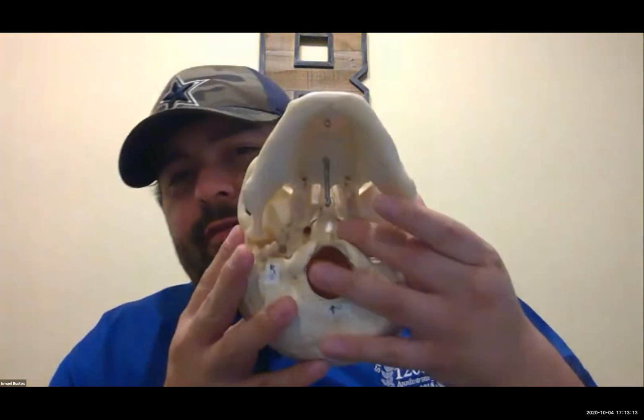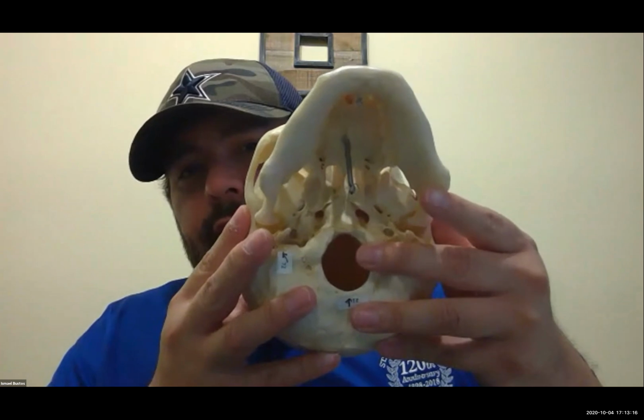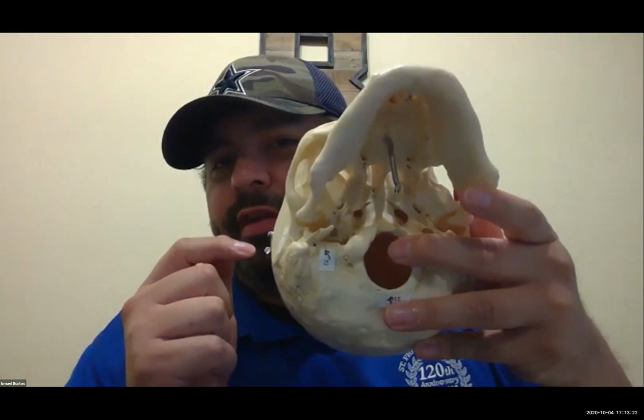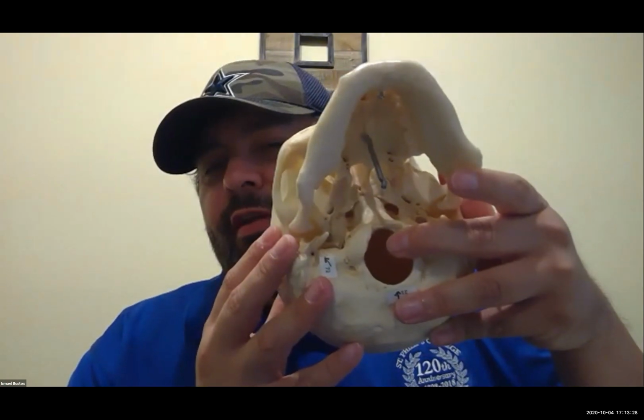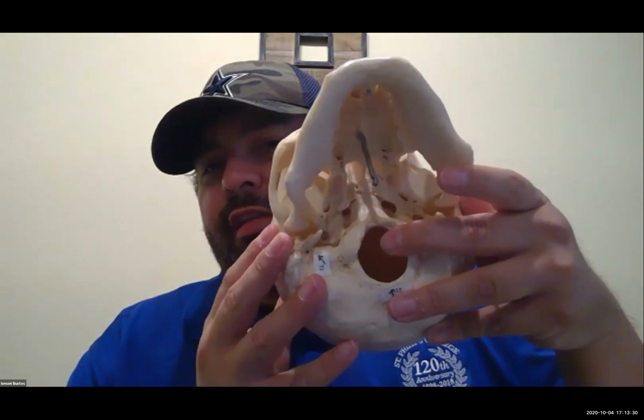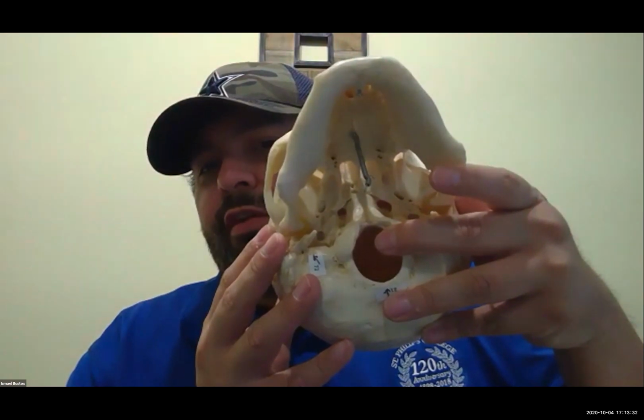So here's the SMV, right? All right, so what we're going to do is look at this zygomatic arch there. Hopefully it's, you can't see it because it's superimposed over the back of the skull here, right? So we're going to rotate the head 15 degrees towards the area of interest, and then we're going to tilt 15 degrees towards the area of interest.